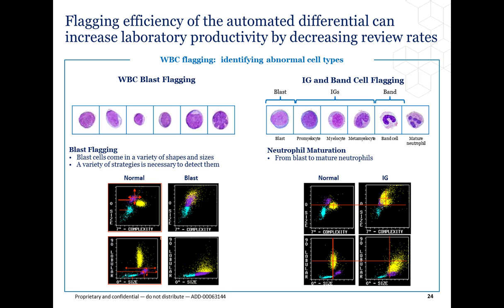The laboratory must also set their own flagging response criteria. The International Council for Standardization of Hematology has published initial guidelines which each laboratory should review and adjust their protocols to their respective patient populations with respect to flagging conditions. Reduction in false positives and minimizing the number of false negatives have continued to improve with every iteration of next generation systems.